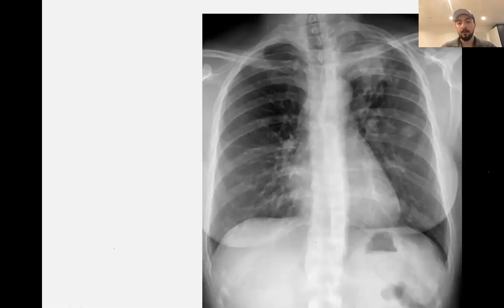Okay. Now, one of the OSCE questions that come in the OSCE exam is actually... I'll ask someone to answer this, and then I'll ask the OSCE question. So anyone wants to have a go at this? I would suggest you actually try to have a go because that might come in the exam.